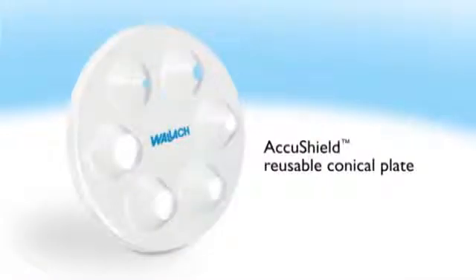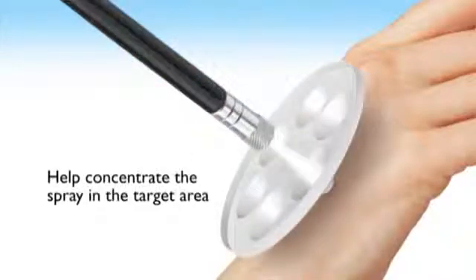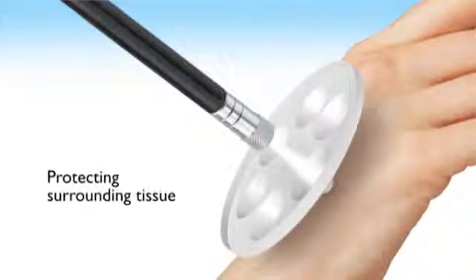The AccuShield reusable conical plate, with six openings of different sizes, is available to help concentrate the spray in the target area, protecting surrounding tissue.